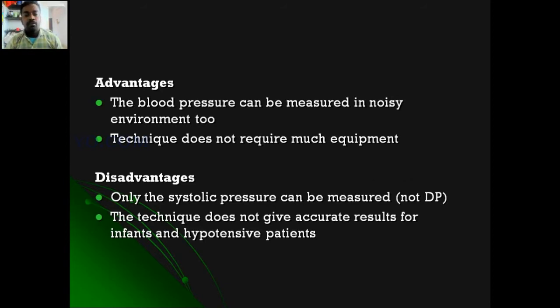The technique does not require much equipment. The disadvantage is that only the systolic pressure can be measured. Diastolic pressure cannot be measured, because the systolic pressure is the highest pressure, and that is the only one we can measure using this method. Diastolic pressure is not possible because that is a very low pressure. That is not possible by this method.